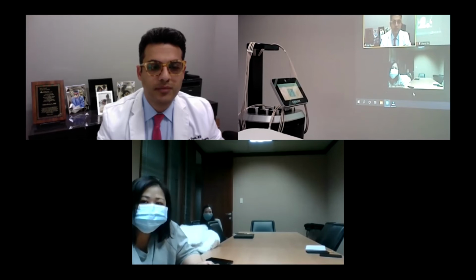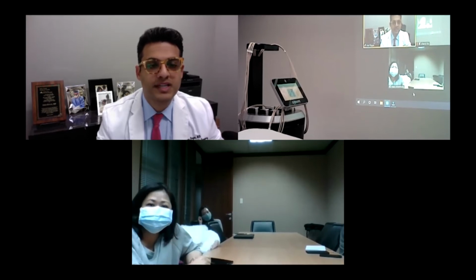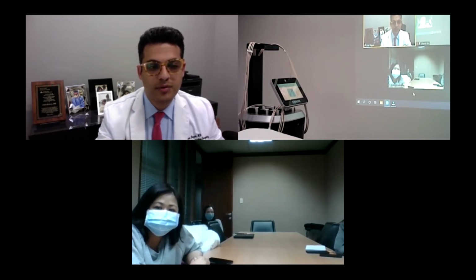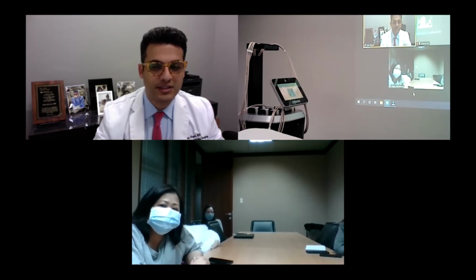It's an arbitrary number, a power of 50. I can tell you, professional athletes, some of the most athletic patients I have, typically cannot tolerate higher than 32, 33. So basically what we do, and different patients are different, some patients are more sensitive than others. So we start at 20 and I just titrate it number by number until the patient is comfortable but feels it. And you can really see the muscle stimulation.